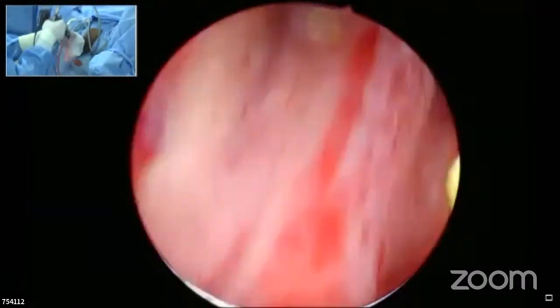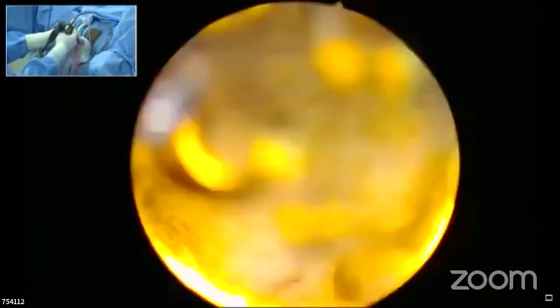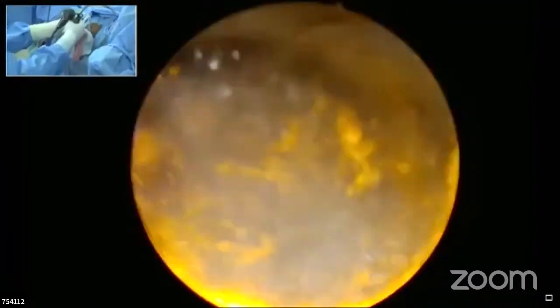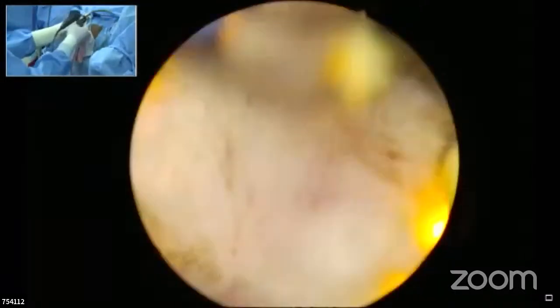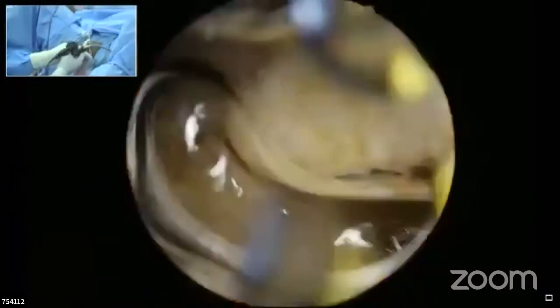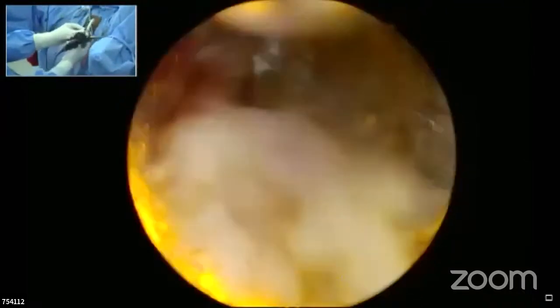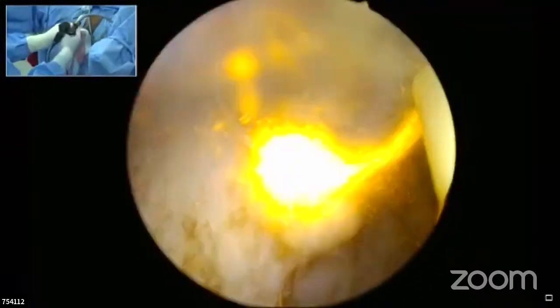Exactly, sir. Exactly. That is the same thing I think he's adopting there also, he's trying to preserve the mucosa and trying to scoop out the prostate behind the mucosa. Yeah. Correct. Smaller chips, controlled resection. Don't let the scope come out from the place.